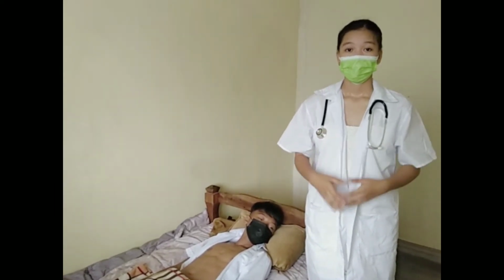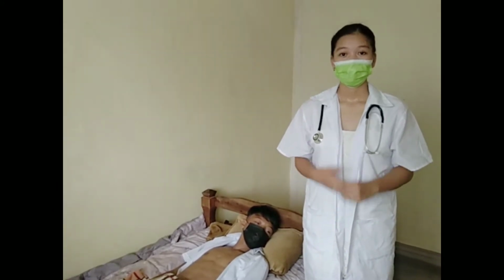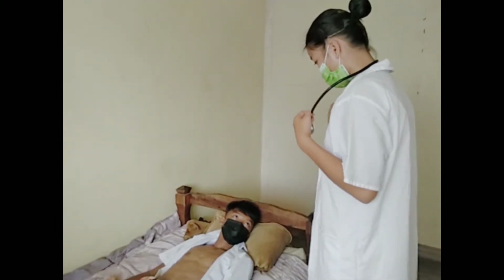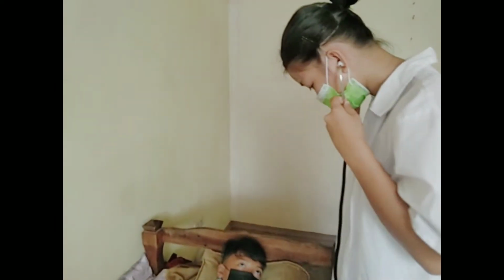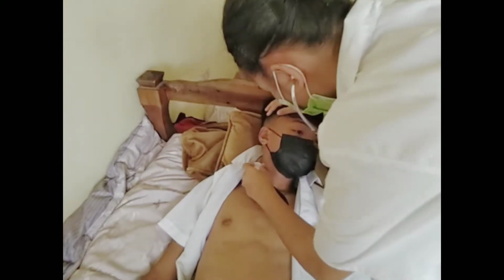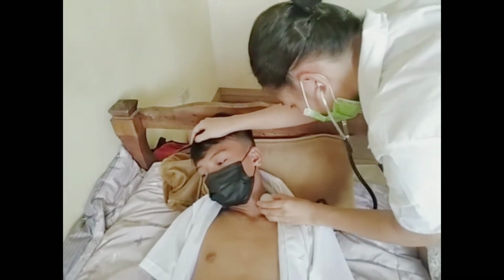Then place the stethoscope over the carotid artery. Ask the patient to hold his breath for a moment, then auscultate the carotid. Okay, sir. I'm going to check your neck. Please turn to the right.